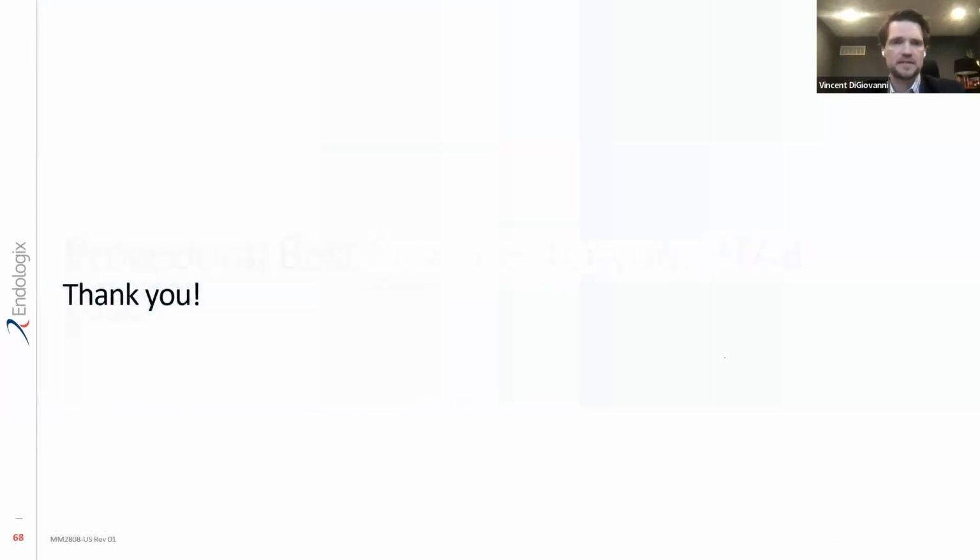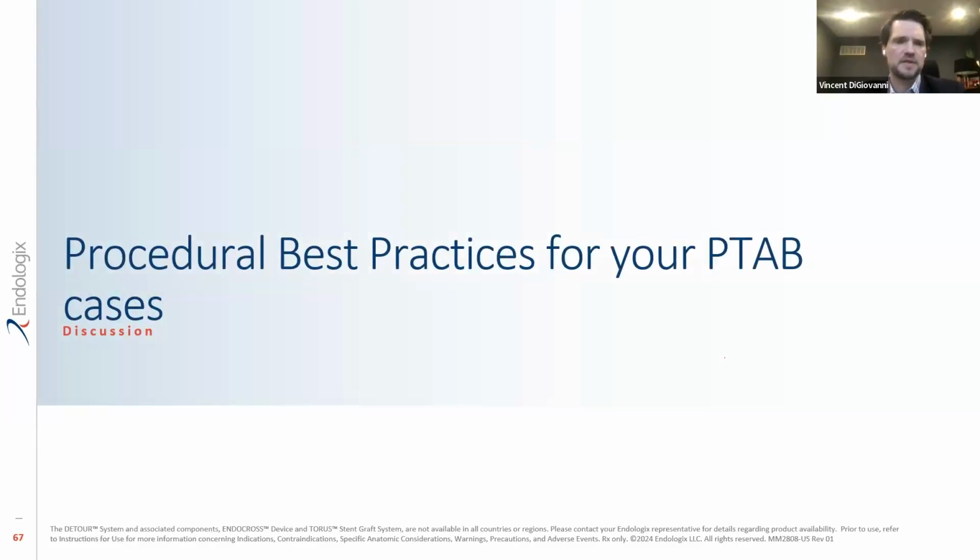So procedural practices, best case, things to help your case go as smoothly as possible. We're kind of running out of time, but I'd be happy to talk about some of the things that we talked about. Pete and Tom, do you guys want to talk? I outlined some of those in my last presentation, and basically we advocate for the telescope technique with regards to getting your catheter down in the distal anastomosis, using an 018 inside of an 035. Again, using the anterior posterior view for firing your device, making sure that you have a really good arteriogram so you know exactly where you're going to be entering. Avoid an area where you've got dense calcium. Make sure you've got good outflow. What else am I missing? I'm sure there's a litany of things I'm forgetting.